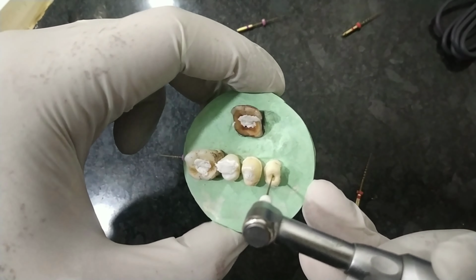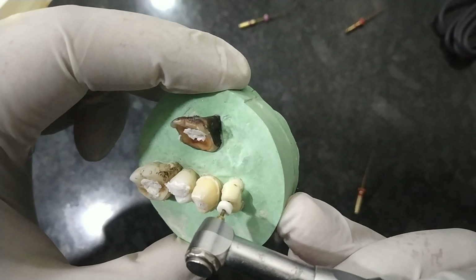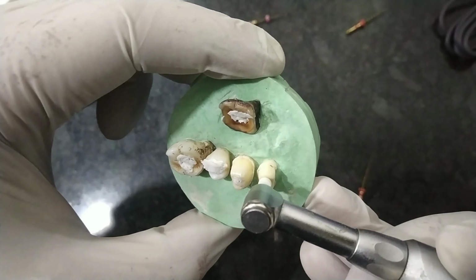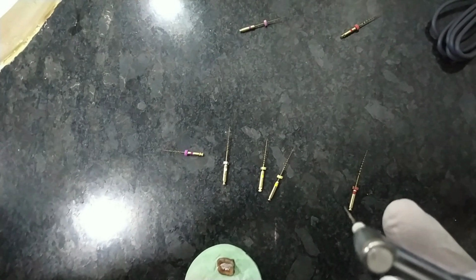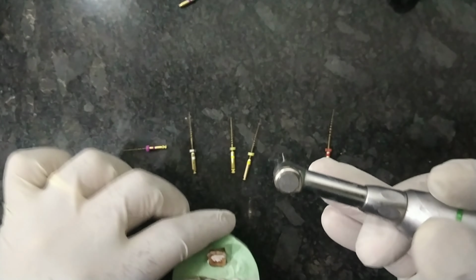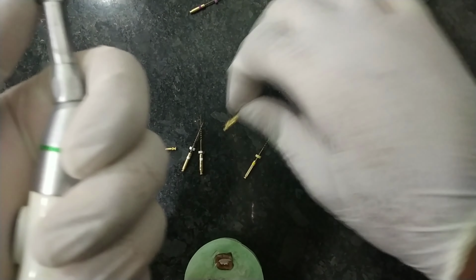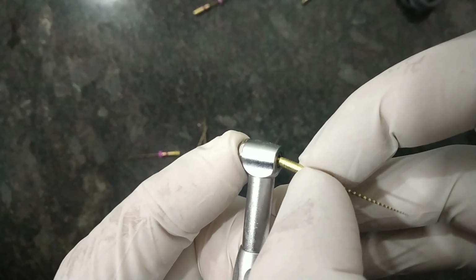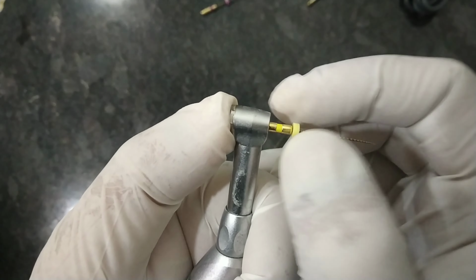After the 10 number file or the path file, we are using the 4% 15 or 4% 20 file. This is 4% 15. Various companies have various specifications. Sometimes I am using Neo Endo, sometimes Hero Shaper Gold, sometimes ProTaper Next, sometimes Sidga files. There are many companies which will give you various deals, and various numbering systems are there. The common ones are, so this is a Neo Endo file which I am using. This is a 4% 20 file. 20 means yellow in color, 15 means white in color.